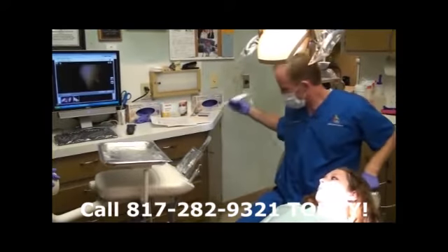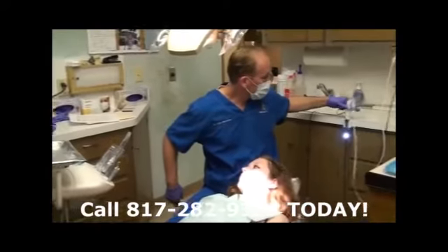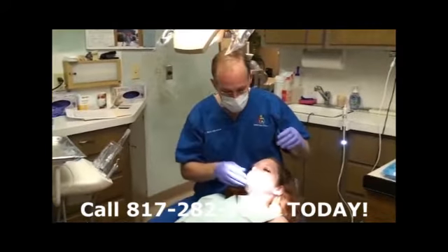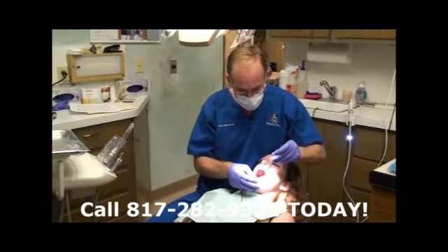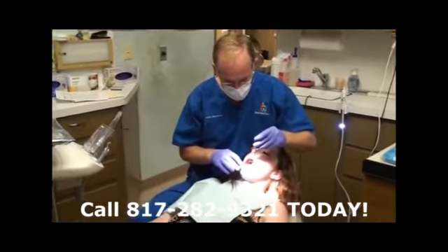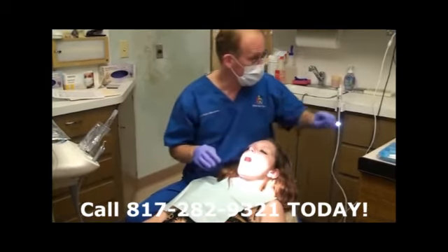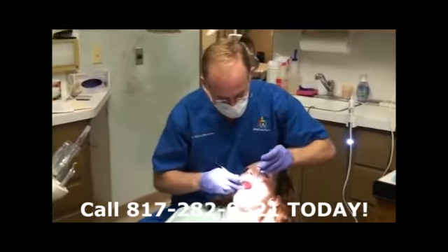Looking around with the camera allows me to see things closer, and you can see it a little bit better than with the naked eye. Then I can show her a couple of those pictures that correspond with her x-rays.